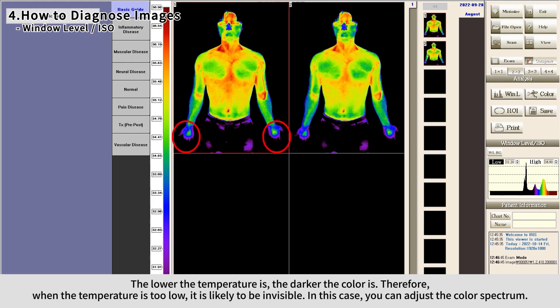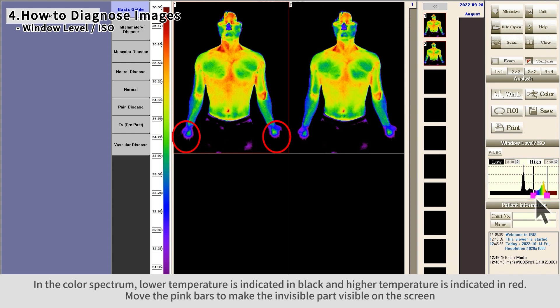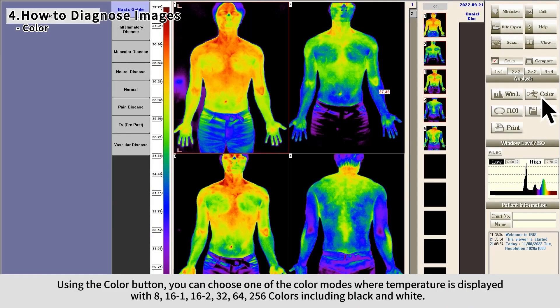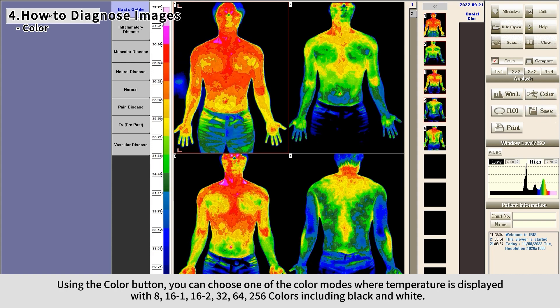The lower the temperature, the darker the color — when the temperature is too low it may be invisible. In the analysis section, click the Win L button to activate the Window Level and ISO section. In the color spectrum, lower temperature is indicated in black and higher temperature in red. Move the pink bars to make the invisible part visible. Using the color button, you can choose from color modes displaying temperature in 8, 16-1, 16-2, 32, 64, or 256 colors, including black and white.